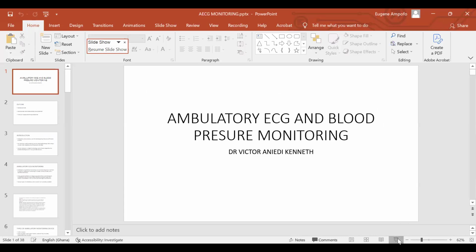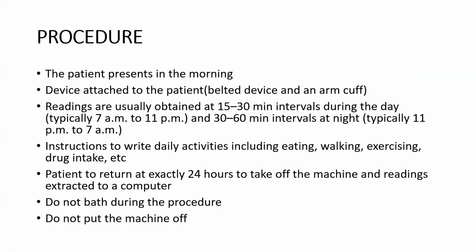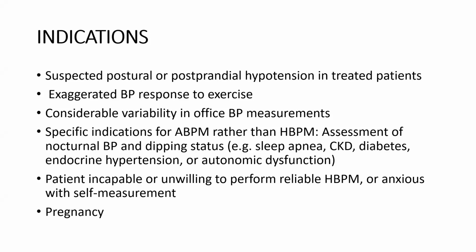Okay, it can also be used for patients that are unwilling to perform or incapable of performing reliable home blood pressure monitoring. If you think the patient won't be able to simulate what happens at the hospital, adequately take the measurements or put down the correct recording, or the patient is too anxious to carry on a self-measurement, it can also be used during pregnancy.